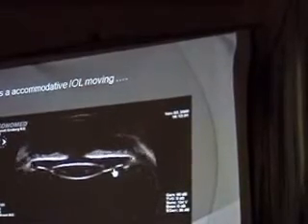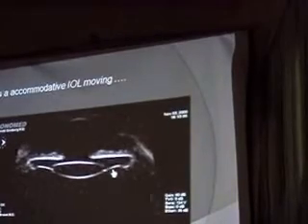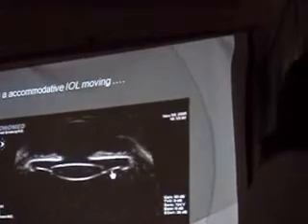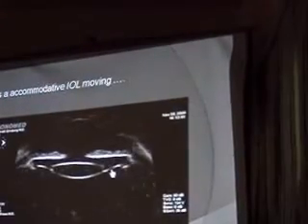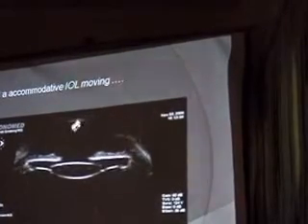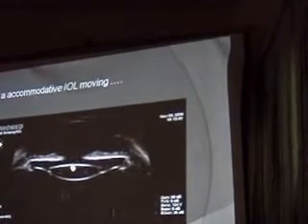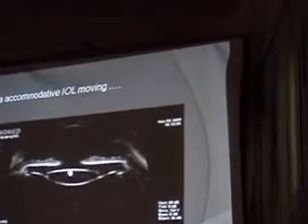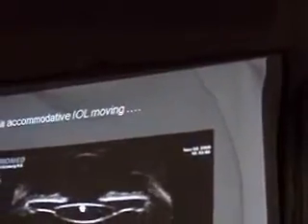How does it come? That means the lens is going against the power that we are looking for near vision. It's true, the lens is bringing you the illusion that it's moving backward, but it's not really true. Measuring these distances, endothelium to the anterior surface of the lens is moving backward a little bit, just microns. But it's not really the main situation over here.